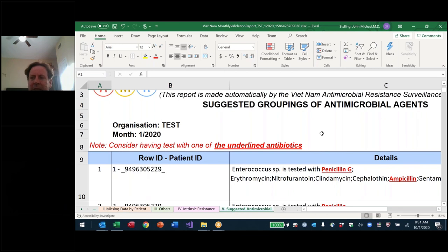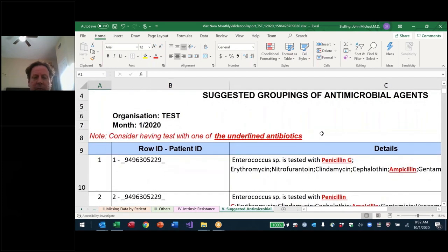I recommend you pick a set, try to get everybody to do that set. If they want to do more than that set, that's fine. There's a certain minimal set of value for clinical reporting and statistics. So this is about that. And that's the end of their data check feedback report from July. They have now taken my recommendations and incorporated them. They haven't incorporated all of them into the Excel document. That's more programming, but they have updated it into their interactive web interface.